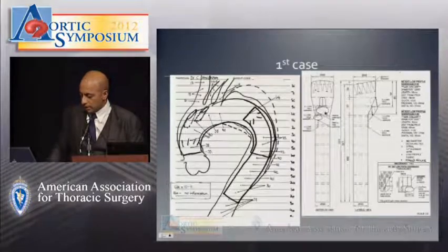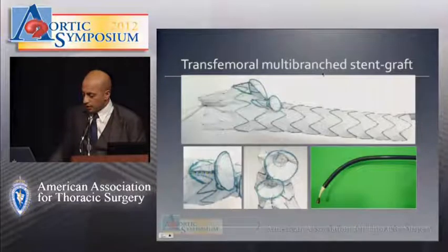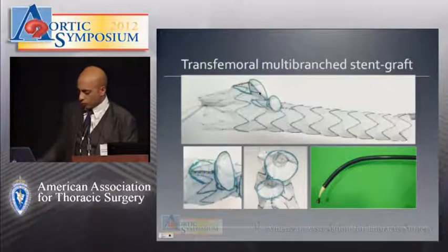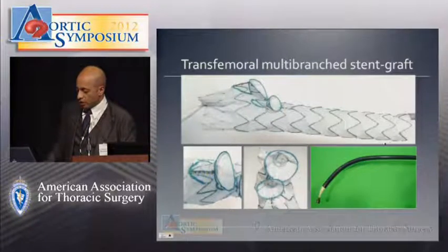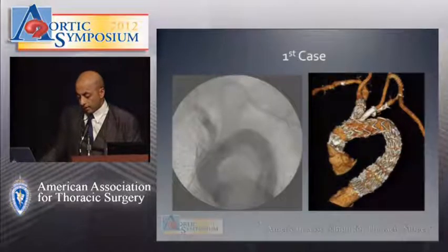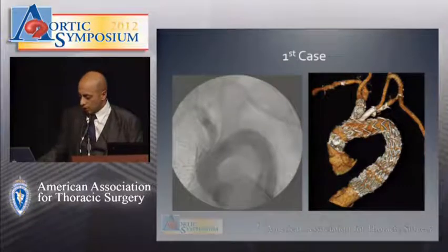As you can see, it had very different branches than what I've described to you. It had external branches, which we thought was a good idea because we thought the funnel-shaped branches would facilitate catheterization from the supraaortic vessels. It did have the pre-curved inner nitinol cannula, which would help with the arch, but it didn't have some of the other features that I'm going to describe that the newer generation does. So this was the first case.